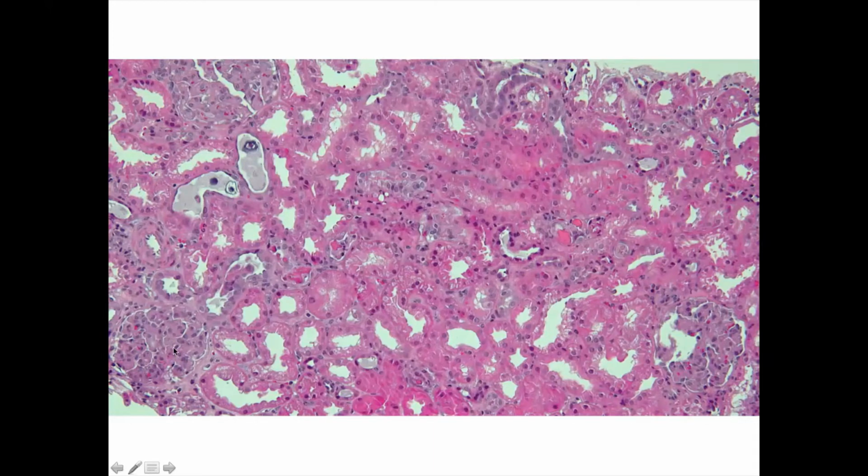There's something going on, and the glomeruli look bloodless. You don't see the loops, they are not patent at all, right? They are not patent at all. Let's see what the chat says. Okay.